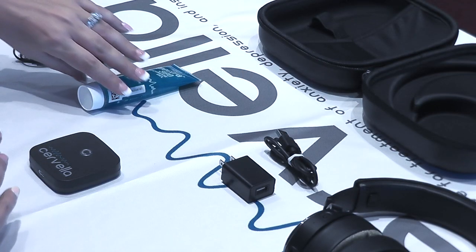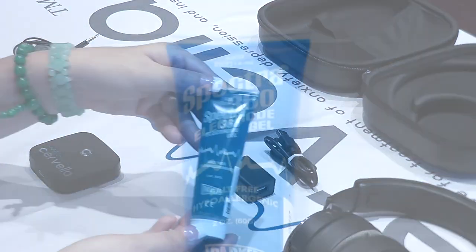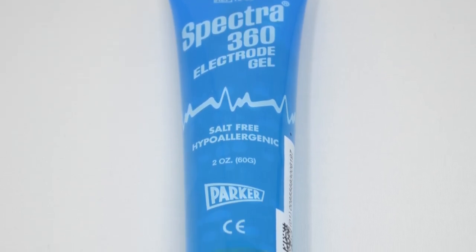This is the conductive gel. You should always use the conductive gel during treatment, as it allows the electric current to flow freely from the headset electrodes through your skin to your brain.